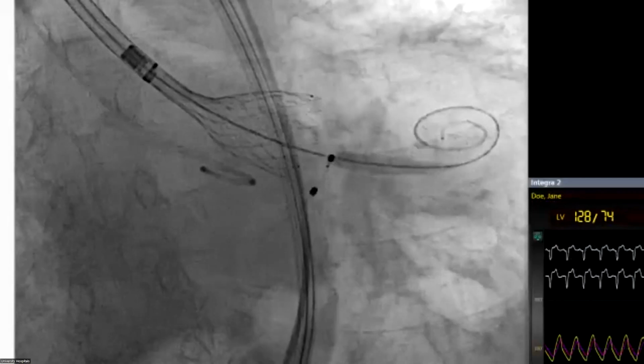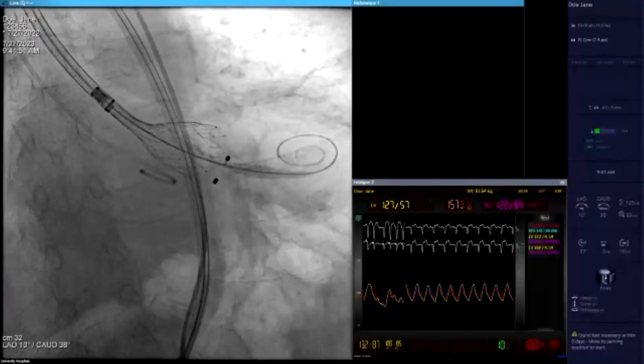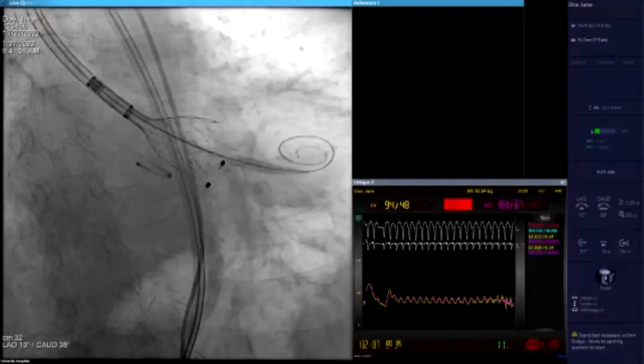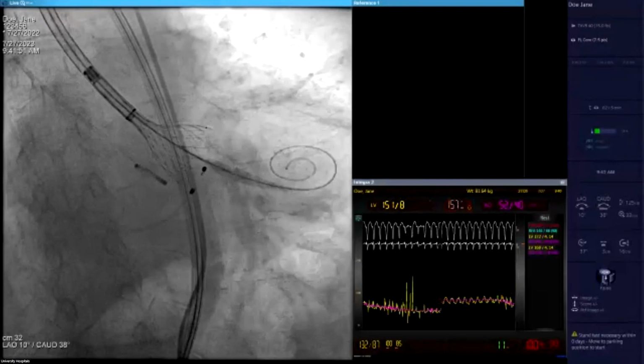All right. Pacemaker on and horizontal aorta, 160. The tension on the delivery system actually. Don't let me lose that. Pay attention here. Use the right hand. Because if it is too pulled up, then it might not align well and it might fall short. If it is too pushed in, then it suddenly jumps in.